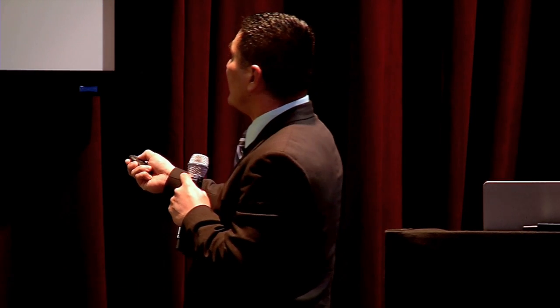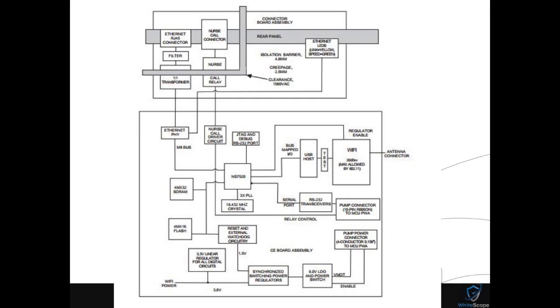So all these wires that you see right here, those are actually a pass-through from when you plug in an Ethernet cable to push that signal directly to the communications board. So essentially, there almost is no difference between plugging it in wired or wireless. So that kind of takes some testing cases off of our plate. Another important thing is to look up here and see that this is a communications board. There's the Wi-Fi module, there's the antenna, and we'll kind of dive into that piece in here in a second.